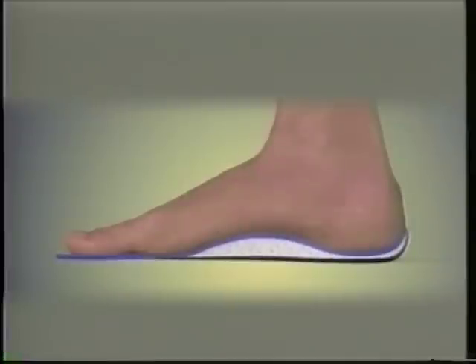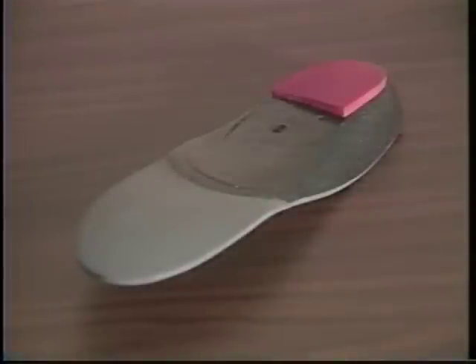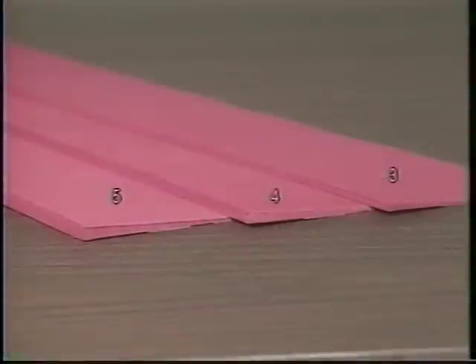This impression mold also becomes the custom-made orthotic without the need for taking a cast of the foot. If additional correction of the alignment of the foot is needed, extrinsic posts can be added to the bottom of the orthotic using ready-made wedges available in 3, 4, and 5 degrees.